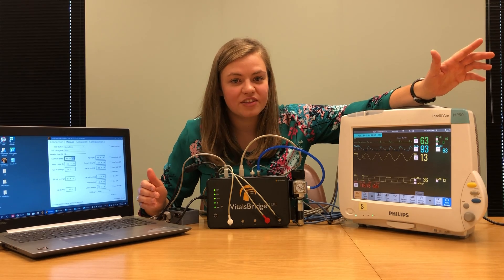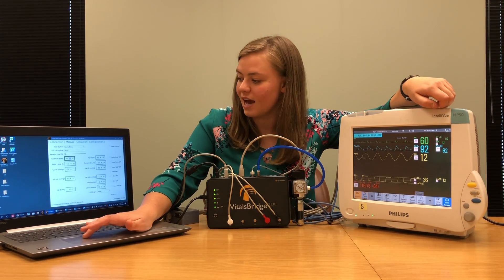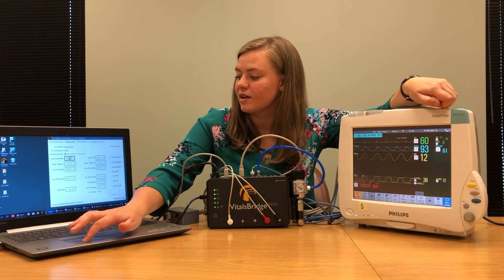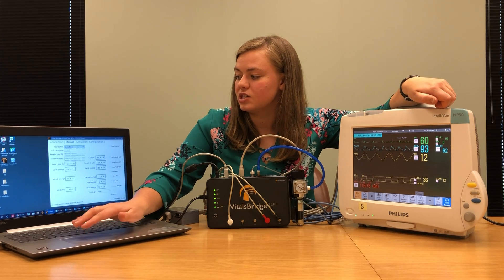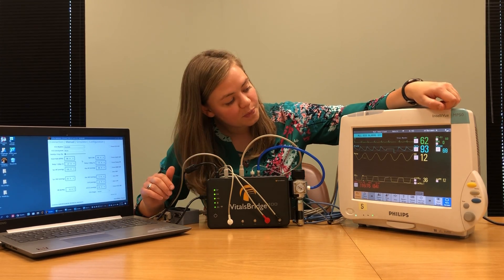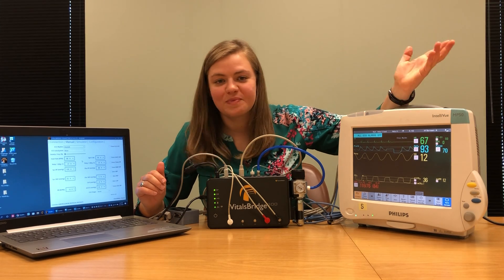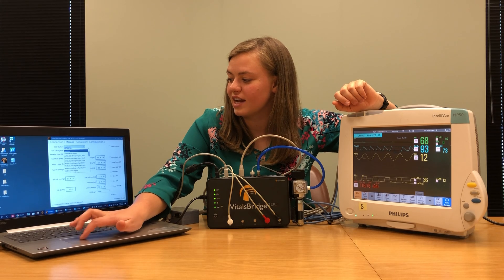Once you've verified the heart rate, you can return it to whatever you would like. I'm going to bring it back up to 80, a nice healthy heart rate. I'm also going to check my ECG rhythms — by changing the rhythm to asystole I should get a flat line. It's working well. I can change that back to normal sinus.